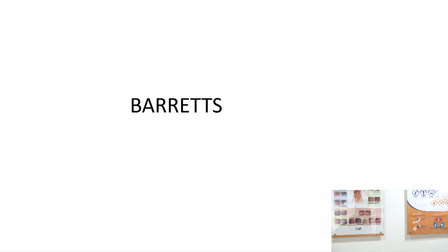Is this classification different from that 1 to 10, V1 to V5? Yeah, Inoue's was a little complicated, then Inoue himself simplified it. And then the Japanese society simplified it further, so you get A, and then you start getting B1, B2, B3.